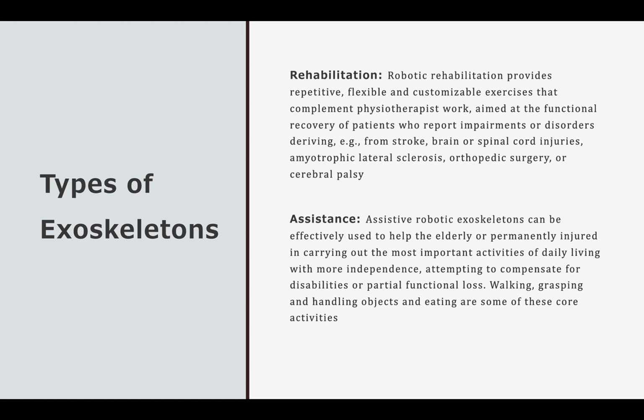Types of exoskeletons: rehabilitation. Robotic rehabilitation provides repetitive, flexible, and customizable exercises that complement physiotherapist work aimed at the functional recovery of patients who report impairments or disorders deriving from stroke, brain or spinal cord injuries, amyotrophic lateral sclerosis, orthopedic surgery, or cerebral palsy.